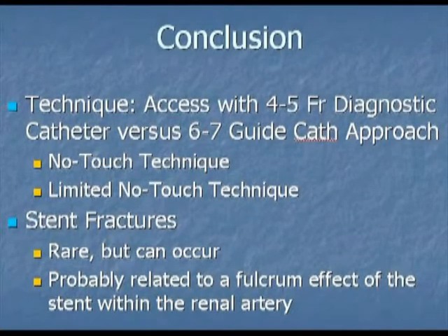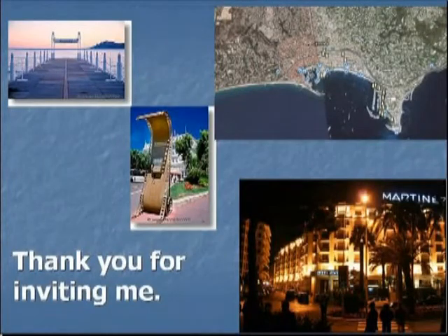We also talked in the second part about stent fractures. As mentioned, this is rare, but it can occur and result in significant hyperplasia and problems, and is probably related to the fulcrum effect of the stent within the renal artery with the respirations, in combination with a weakening of the stent, allowing it to be more flexible.